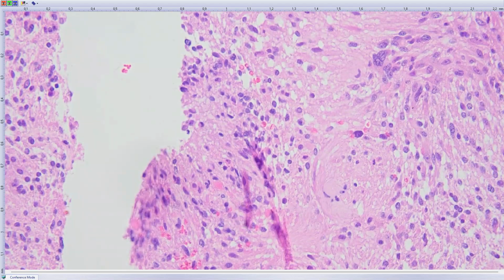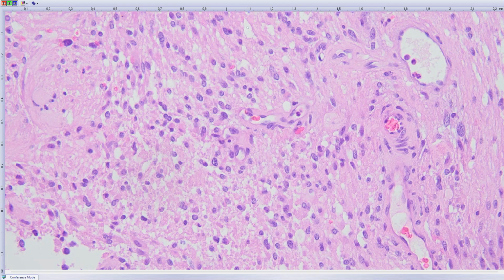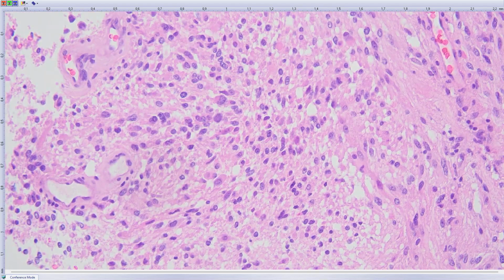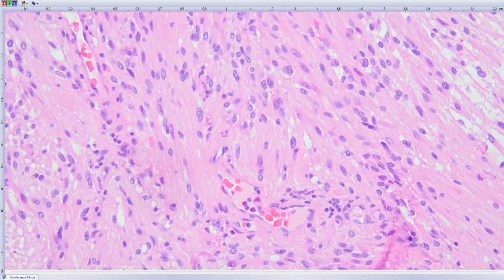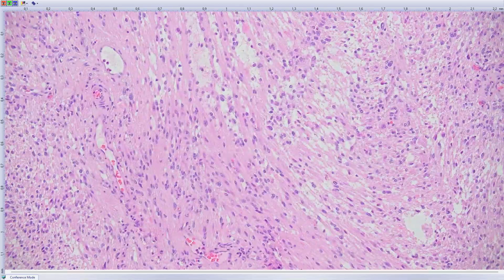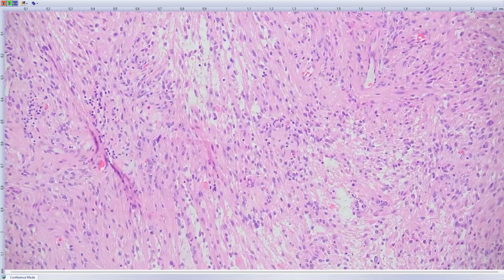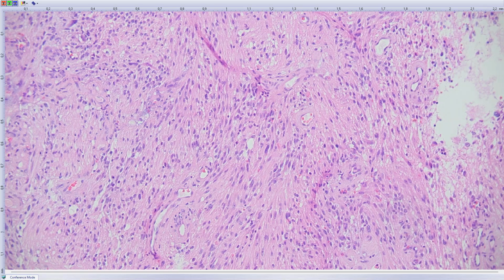There are some interesting findings. Maybe in the middle you see there were eosinophilic granular bodies, EGBs, present. No real Rosenthal fibers found. The proliferation activity was maybe at the EGB, the center here. So it's something piloid looking, and methylation profiling came back with the diagnosis of high-grade astrocytoma with piloid features.